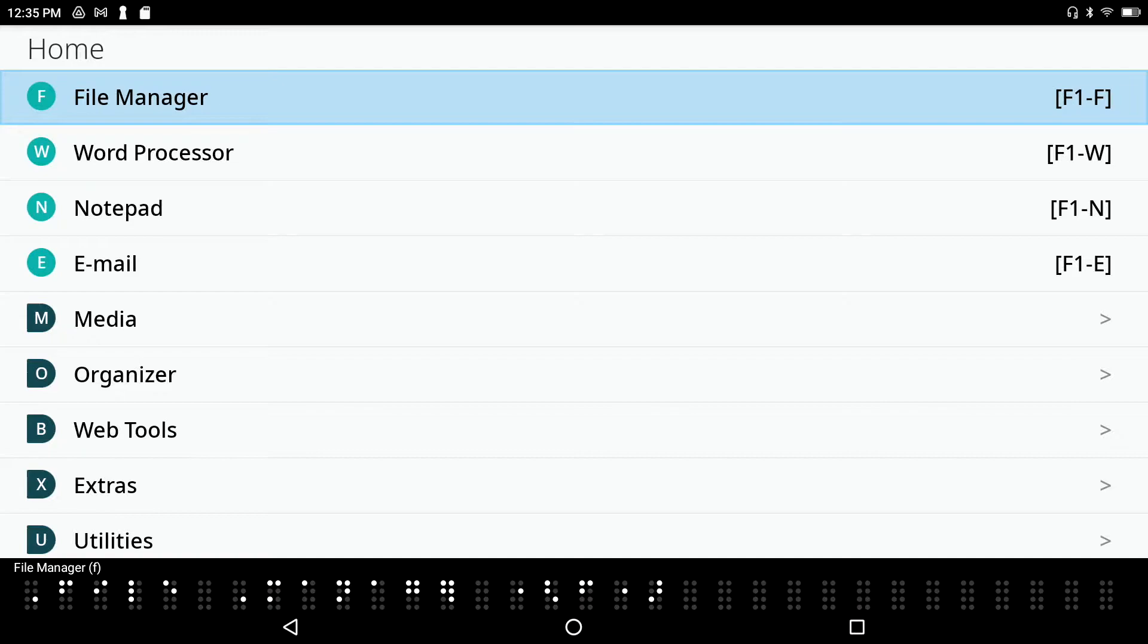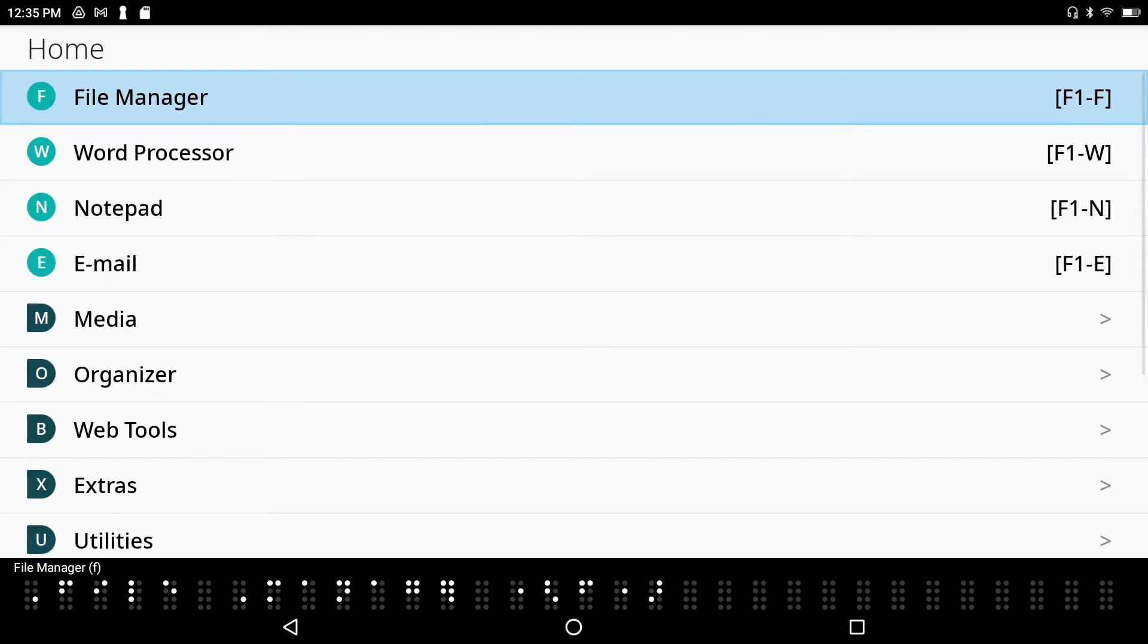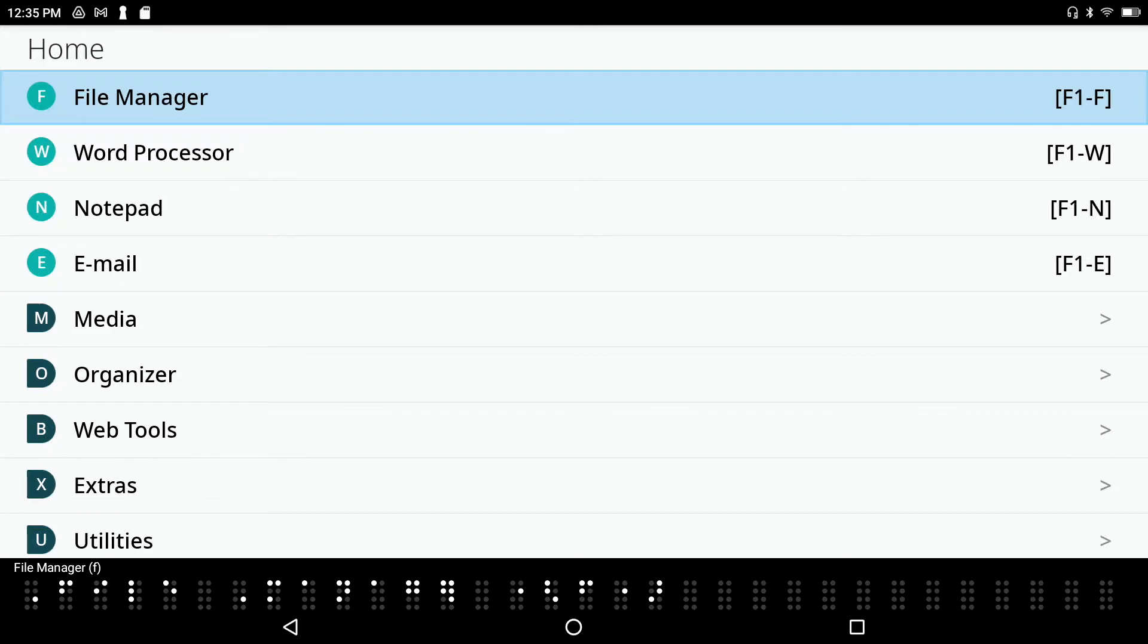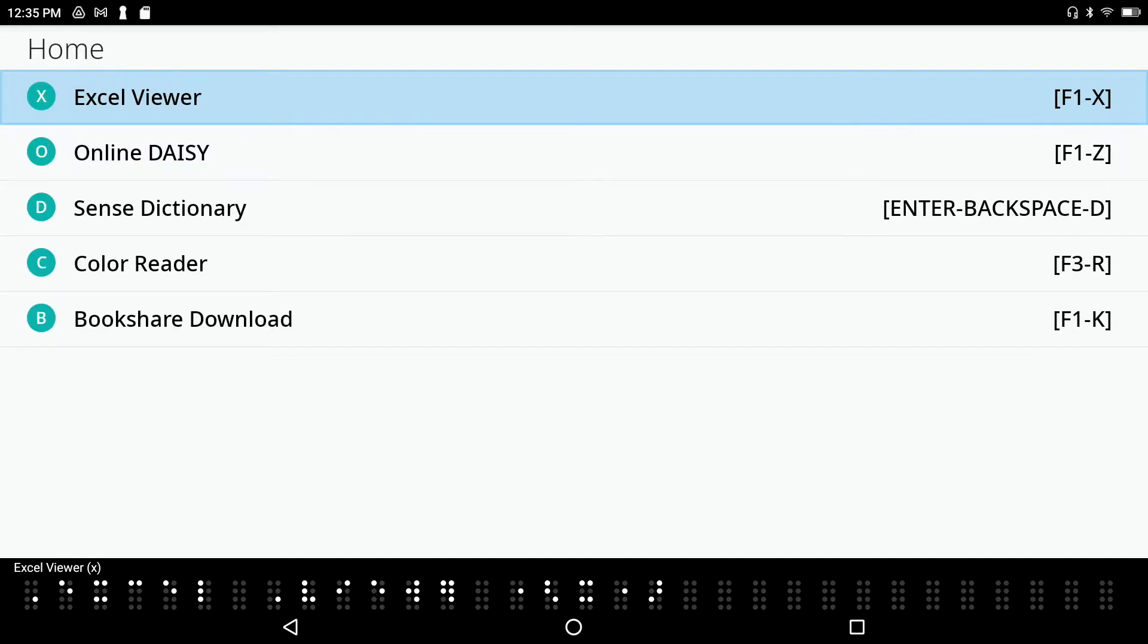is found within the Extras menu. From the main menu, I'll press F1 File Manager to confirm that I am on the first item. I can press space dot 4 to down arrow through the menu system and space dot 1 to up arrow, or I can just press the letter X for Extras. The shortcut key for the Bookshare app is simply the letter B, so I'll just go ahead and press that now.